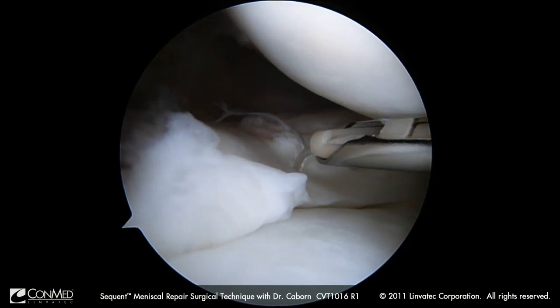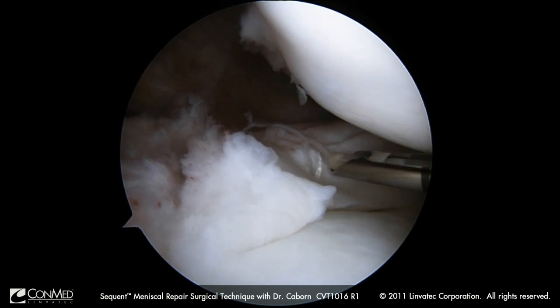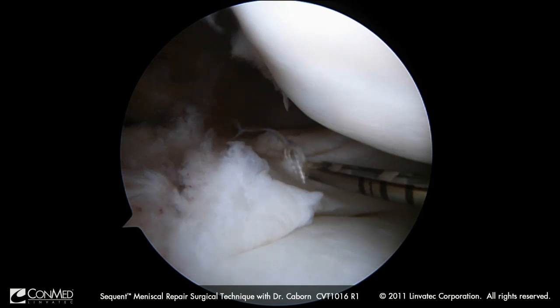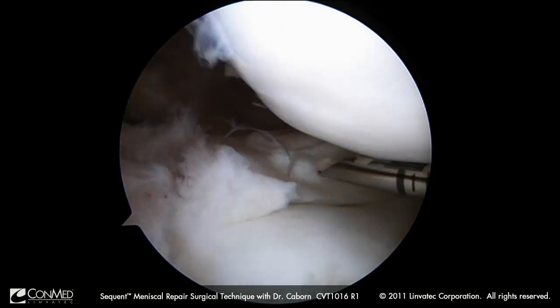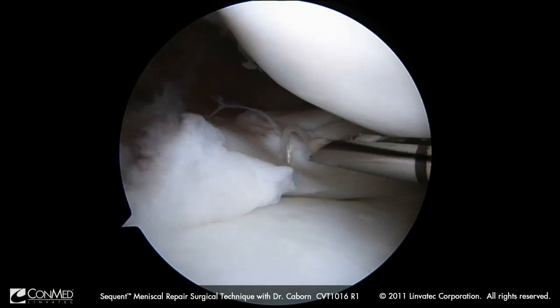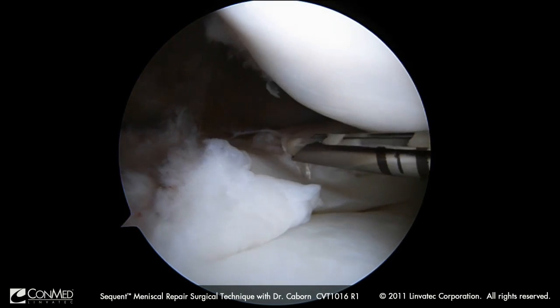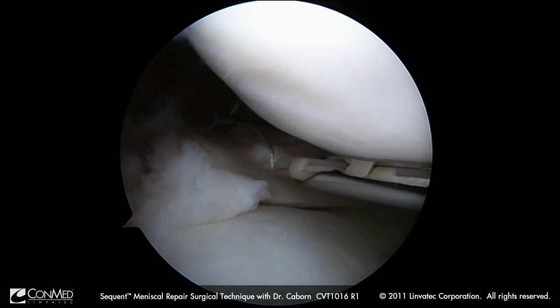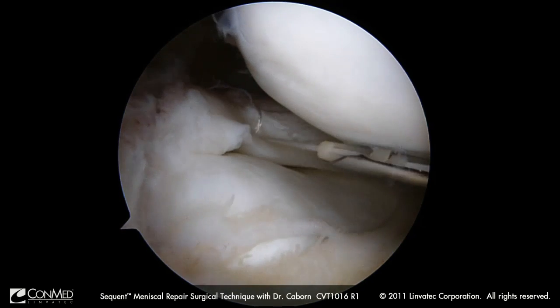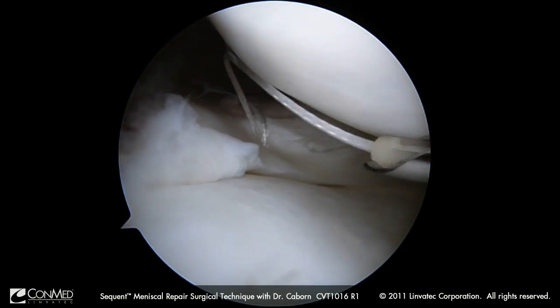I can adjust this tension very finely to make the determination of whether it is adequate, too tight, or too loose — because I do not want the meniscus puckered against the articular surface. This is a linkage system, so I want to repair with tension but not over-tension. Now I am going to take off my ratchet wheel and go into freewheel mode to allow me to re-establish the loop that I want.